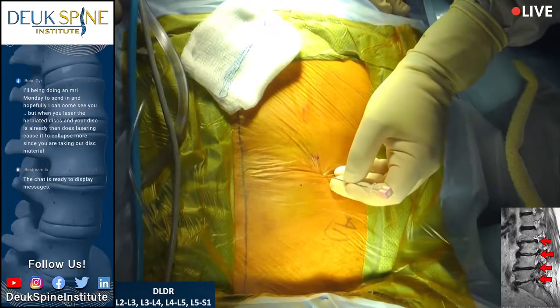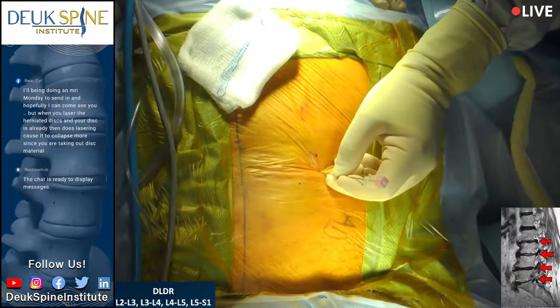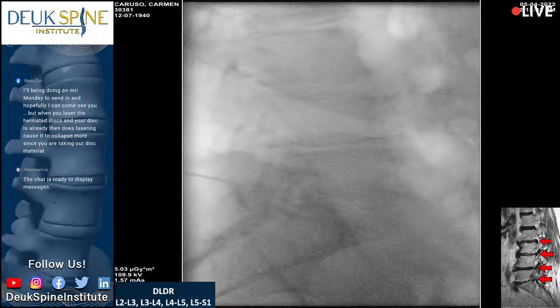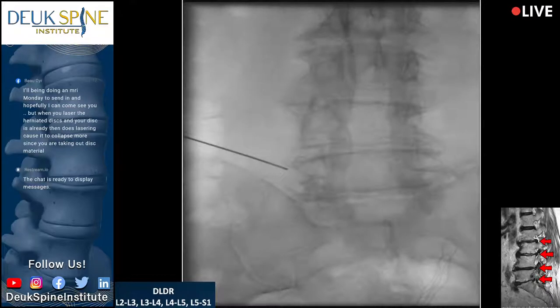Okay, let's keep that head down and let's go. Shot? You're doing great, Carmen. Just relax, buddy. Dr. Duke's going to ask you a few questions. Huh? Give me an AP. Just lay still. The more he moves, the harder it is and the longer it's going to take us. So if you can get him comfortable to where he's not moving. Yep. But we have to find it. You can actually see his prior laminectomy there. All right. Let's go back to a lateral.